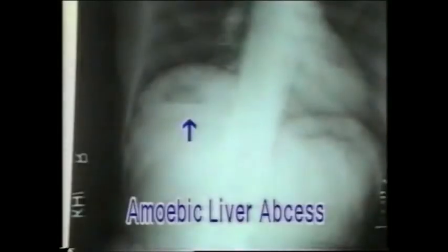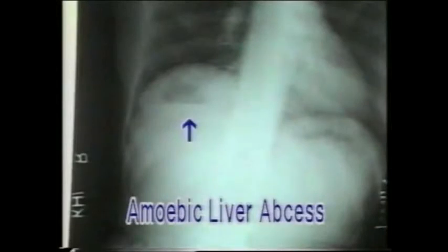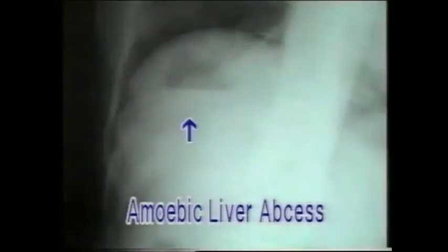This is another X-ray showing a fluid level in an amoebic liver abscess. Note that its upper border does not match with the diaphragm, that it is entirely within the liver shadow, and that it does not extend along the full width of the diaphragm.